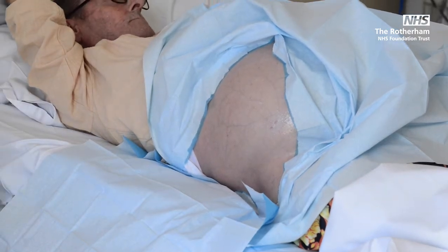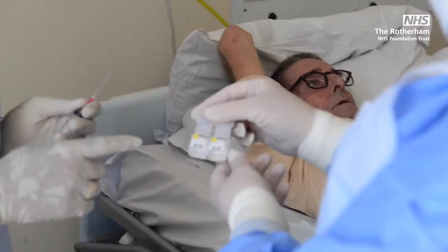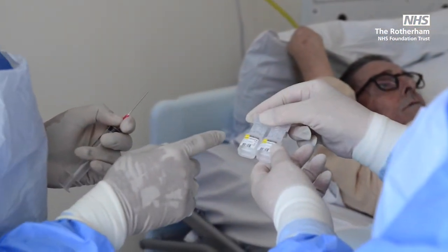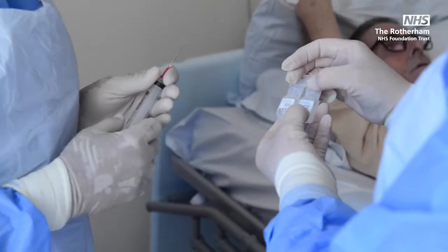And we have some lignocaine next. We're going to take some lignocaine. That's 1 or 2% lignocaine. I'm going to take 10 mL. So this is 1%. Just check the dates. They're in date. Great, thank you.